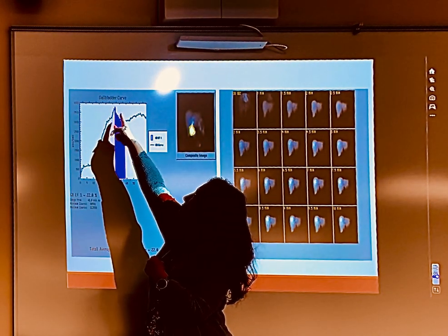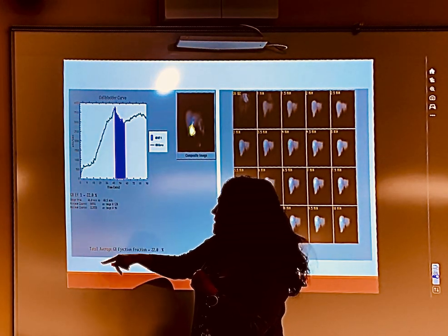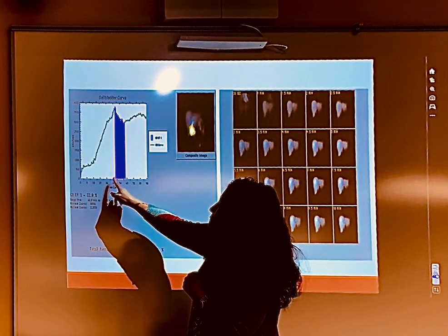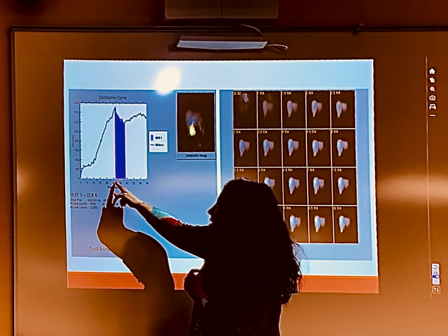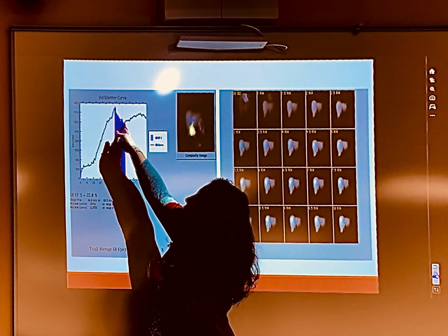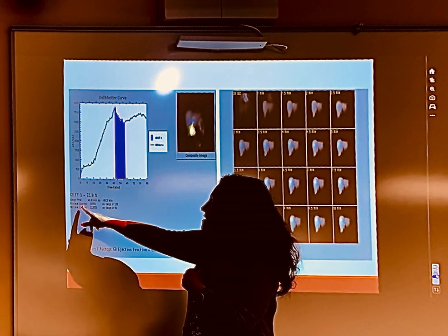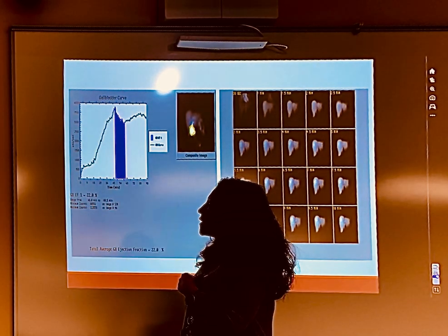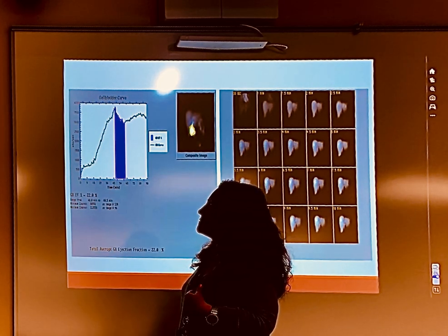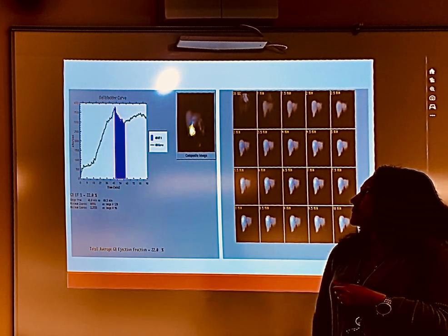Now this is the highest point. We gave CCK, I didn't even say when you gave CCK, but I'm assuming we gave CCK at 45 minutes, 50 minutes maybe. So then it takes the high to the low, and that's how it does your maximum minus minimum, because here's your max. Your maximum counts are 113,558, and your minimum was 88,551. So that's how it gets that 22% ejection fraction, which it calculates at the bottom.